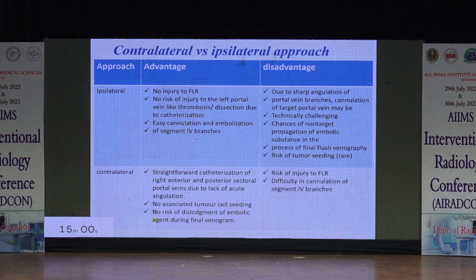We have seen 2 cases, one we did contralateral, one we did ipsilateral. Please, sir. The ipsilateral approach is good for the patient because we are not touching the future liver remnant. Contralateral approach is good for the doctors because it is easy to manipulate. So because we are patient first, we always take the ipsilateral approach. Contralateral approach is very rare.